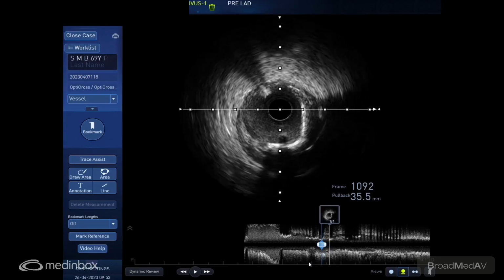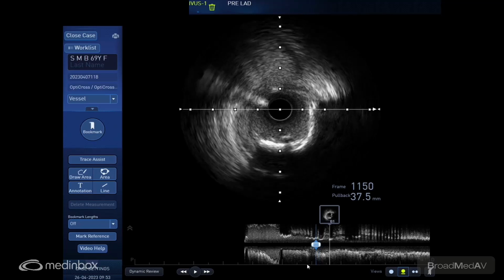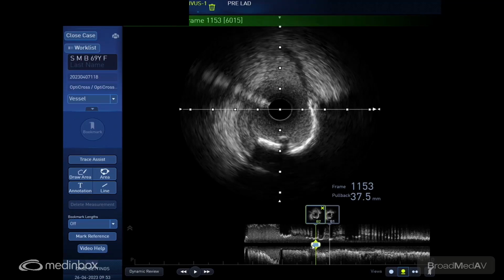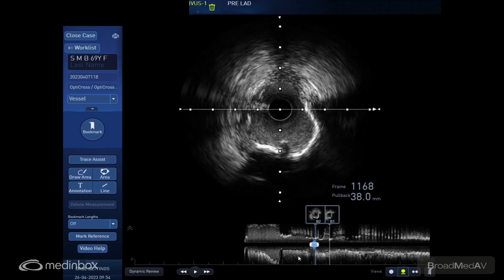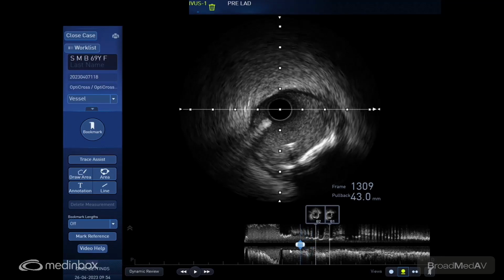As we come beyond at the proximal LAD, this is another diagonal which arises, and over here you can notice at the 6 o'clock junction as well how the Wolverine has cut. The Wolverine really does some great cuts, and I think we have really debulked this lesion pretty well. And so we are ready now to stent the vessel.